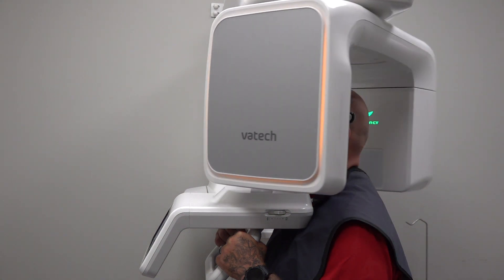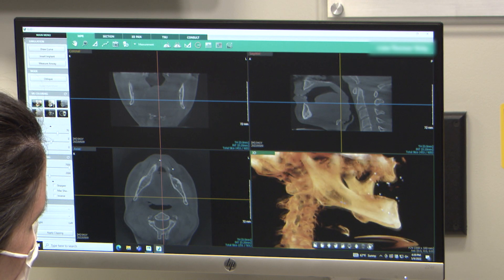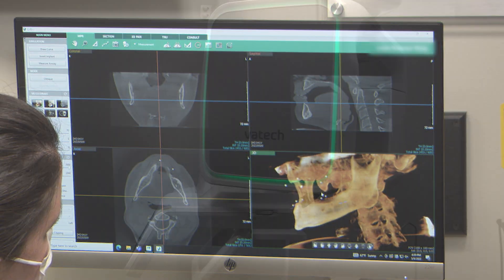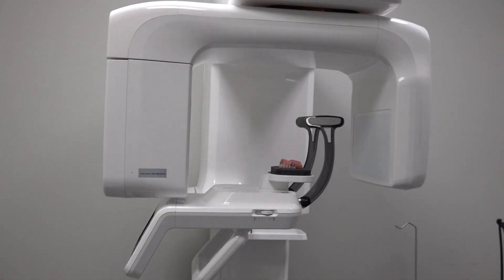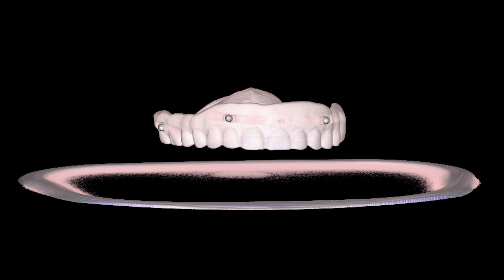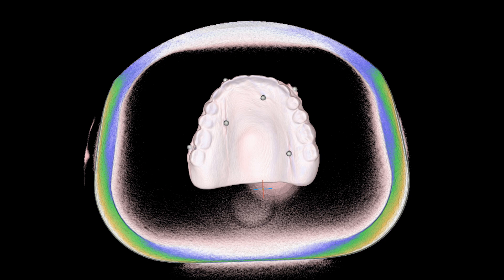The first scan is of the patient wearing the denture with the fiduciary markers in place. In the patient's scan, the radiographic markers should be easily visualized along with the patient's bony anatomy. The second scan is of the denture all by itself. The position of the fiduciary markers should not be moved from one scan to the next, as these markers are how the two scans are aligned together. If both the upper and lower are being evaluated for implant placement, each denture should be scanned individually.